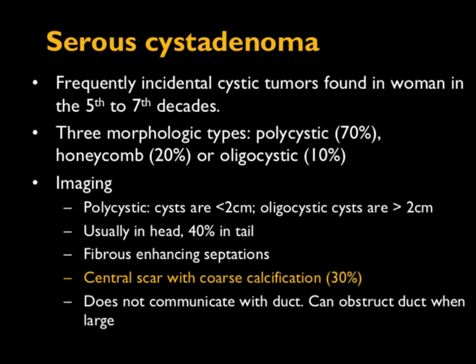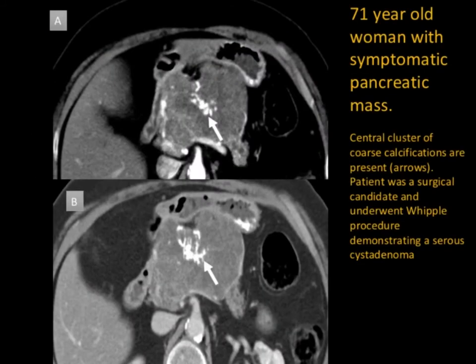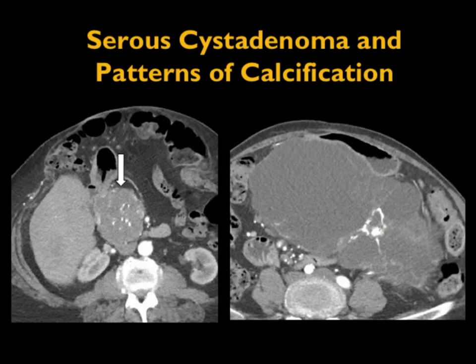A lesion we commonly associate with calcification is serous cystadenoma, usually an incidental finding. Polycystic is the most common form; oligocystic is the least common. Cysts are usually under 2 cm, typically in the head but can occur in the tail. Septations with a central scar are not uncommon, with coarse calcifications in 30% of cases. Here's a nice example: large cystic lesion, central coarse calcifications, mass effect, typically no duct obstruction — serous cystadenoma.